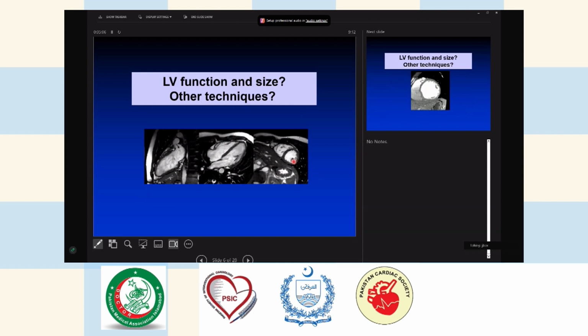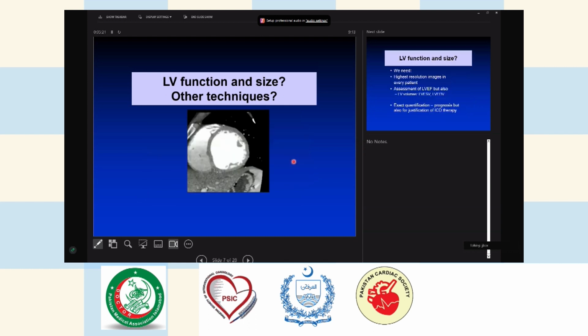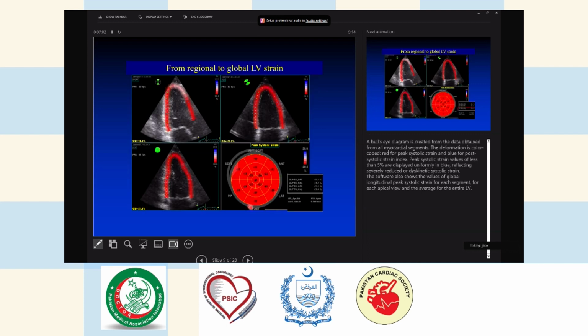We cannot do an MRI in every patient, but if we could, we would certainly like that better than an echo. But again, with echo, we move mostly from 2D to 3D in complex cases. We also have CT scans. Here's a CT scan, and we use that mostly for coronary arteries. But you see here a very bad ventricle, very easy to pick up, relatively thin wall, posterior, lateral, and anterior.